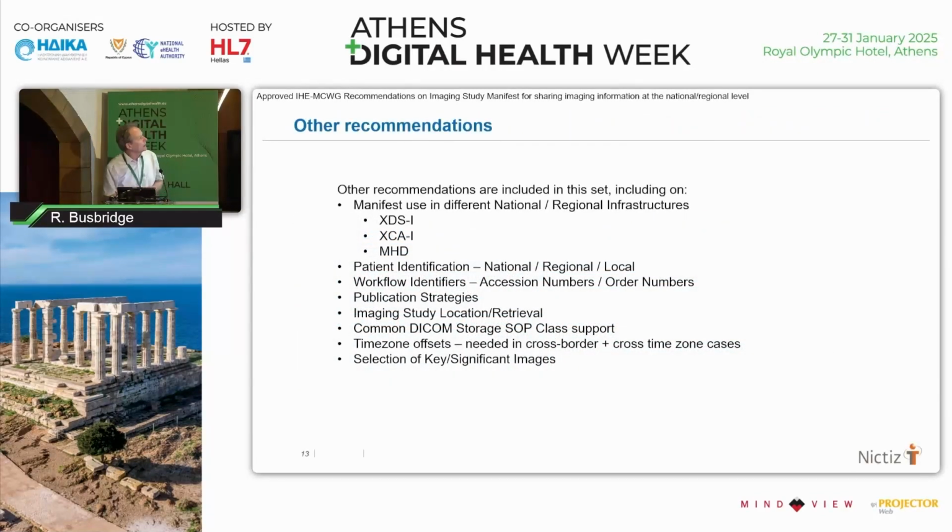There are a whole load of other recommendations in this, including, as Charles has pointed out, in the first recommendation we have a standards positioning, which, based on the national and regional infrastructures, identified the kinds of IHE profiles that should be used. And we know that in existence today we have XDS-I domains, we have XCA. We're moving to the ability to use FHIR, we'll have an MHD domain. So we are saying that the use of this manifest can be deployed across any of those profiles. We're not saying that it only applies to the use in XDS, for example.